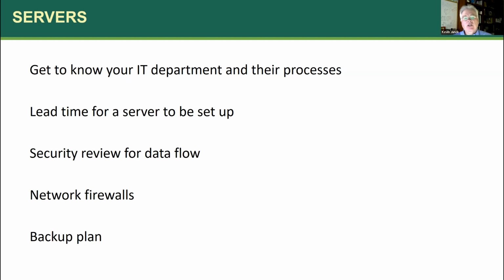Within an institution, network firewalls, that's a big issue. Again, in the name of security, we've got to keep things kind of tight. So our MR scanner can't just talk to anybody in the institution. That's a good thing. If somebody were to break into the network at UAB, you don't want them to have carte blanche access to everything at the whole institution.